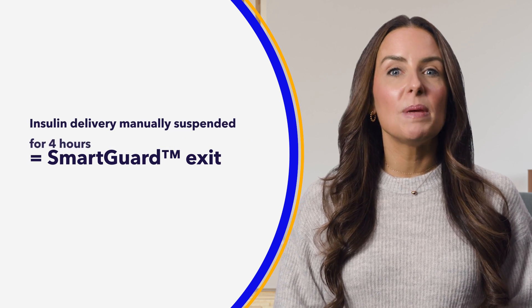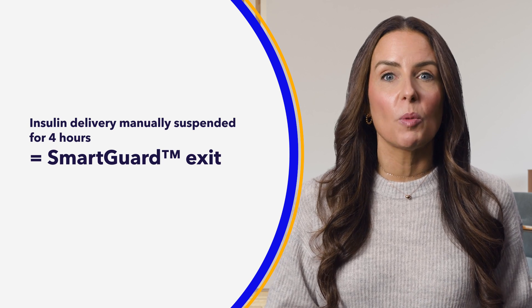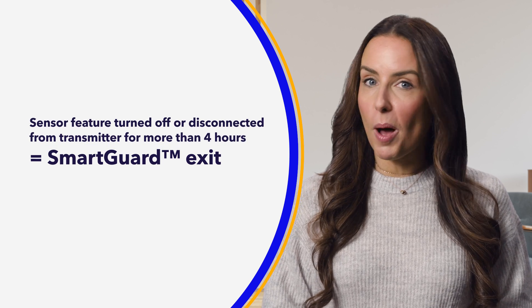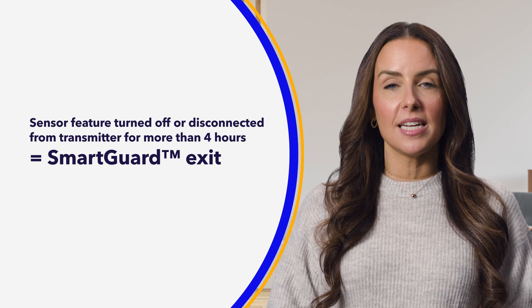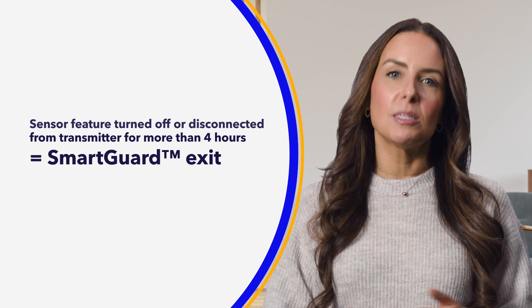Insulin delivery that's been manually suspended and not resumed for 4 hours will also lead to a SmartGuard feature exit. And lastly, if the sensor feature is turned off on your pump or the sensor has been disconnected from the transmitter for more than 4 hours, you will experience an exit.